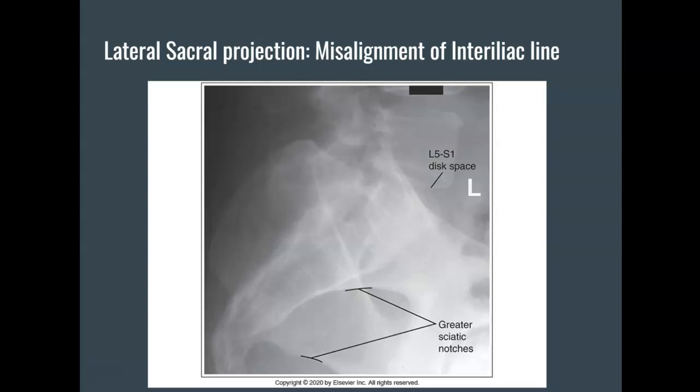If you do not place that sponge adequately to get that interiliac line perpendicular with the IR, your sciatic notches will be misaligned.